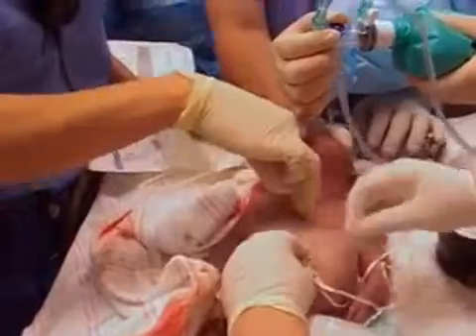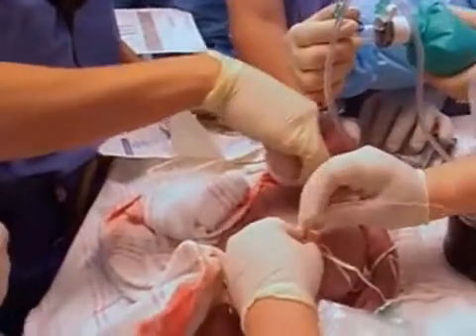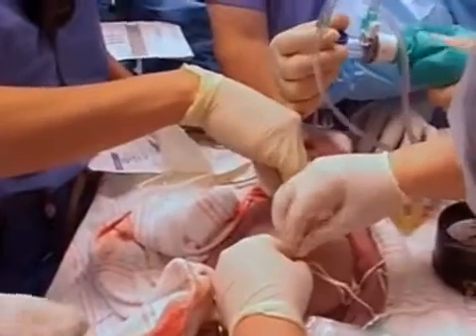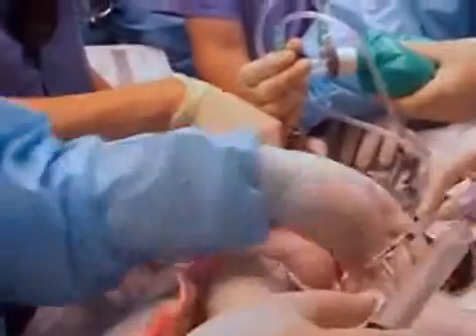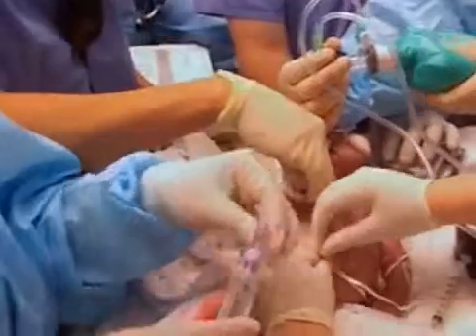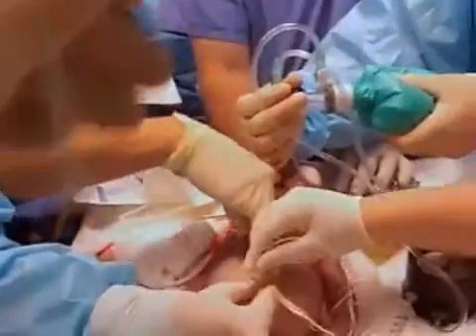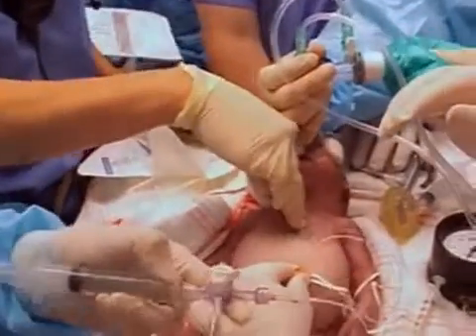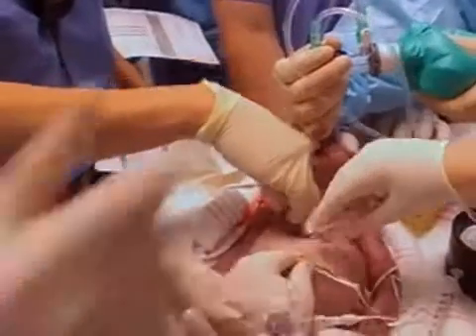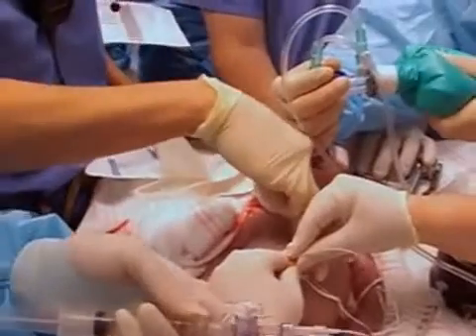If an assistant isn't available, you can tie the cord at the base with a cord tie and cut the umbilical cord 2 centimeters above the skin. Quickly insert the umbilical venous catheter into the umbilical vein to a depth of 3 to 5 centimeters below the skin. In a full-term infant, check for blood return and secure the catheter between your fingers or with tape. It is imperative that the catheter not be inserted too deeply, as it may enter the hepatic vessels, in which medications administered during the urgent situation could potentially cause hepatocellular damage.